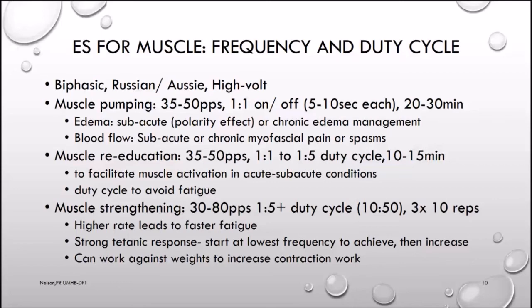My pulse rate looks pretty similar. My duty cycle, I might start at a 1-to-1 or a 1-to-5 duty cycle, depending on how much fatigue. The more off time or rest time there is, the less fatigue. And I'll do this for a shorter amount of time. My purpose in doing this is to facilitate the muscle activation in an acute or subacute condition. This would be a patient post-op knee surgery whose quad isn't working.